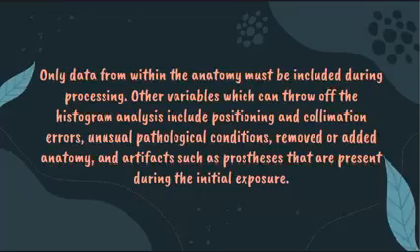of the image. So it is very much important that it is not only applied in film screen systems but also in digital systems such as CR and DR. Dapat collimated ng mabuti ang inyong anatomy when you are imaging, no matter what part it is and no matter how thick it is. If pitch black background densities or the tail of the histogram are included in the computer's calculations, the final image produced will be skewed away from the desired brightness and contrast levels.